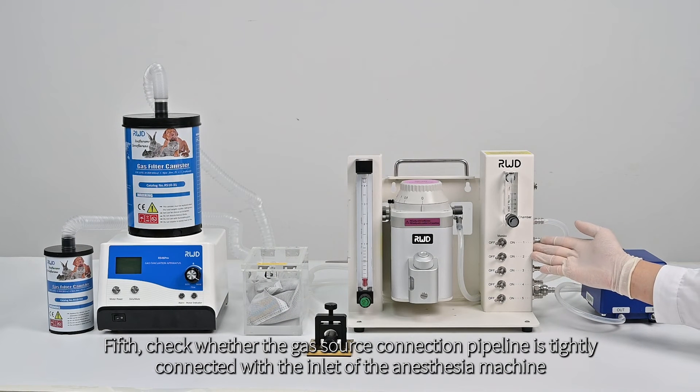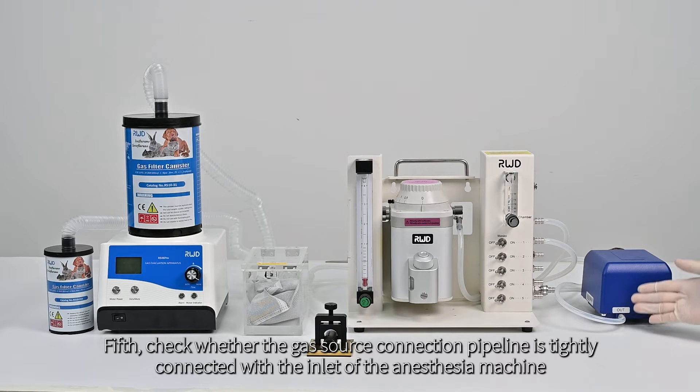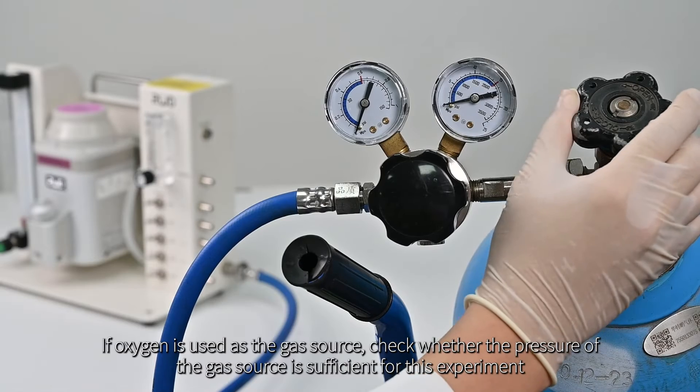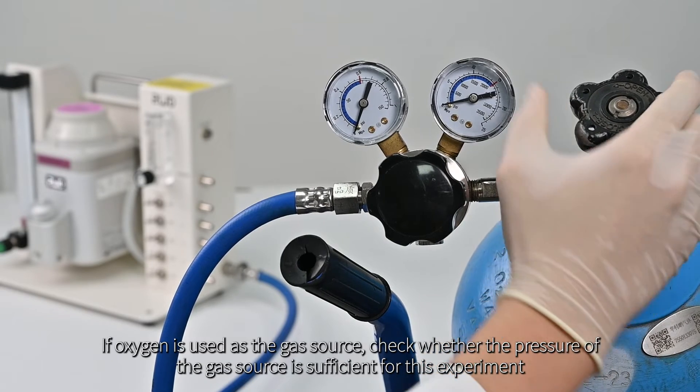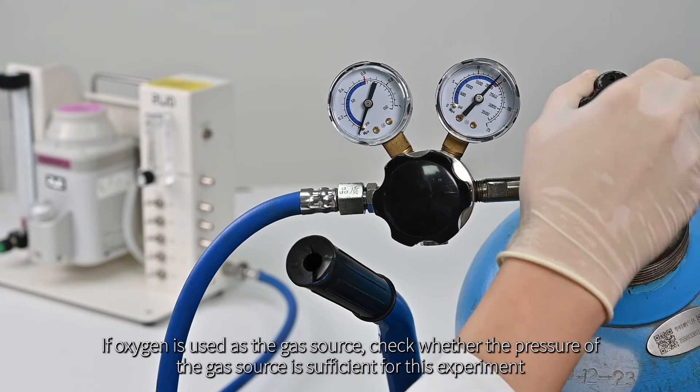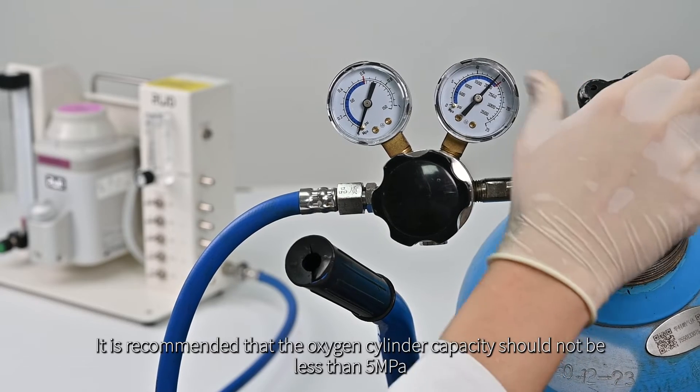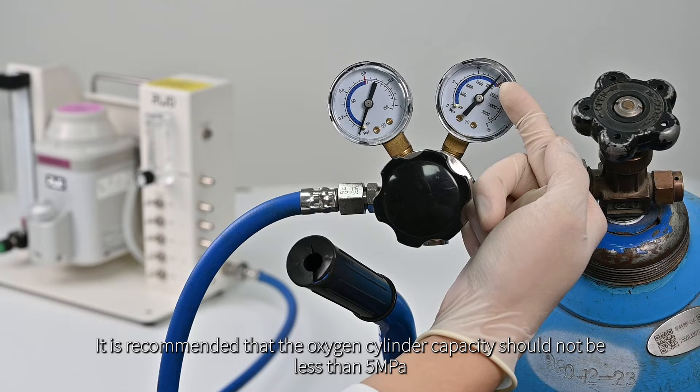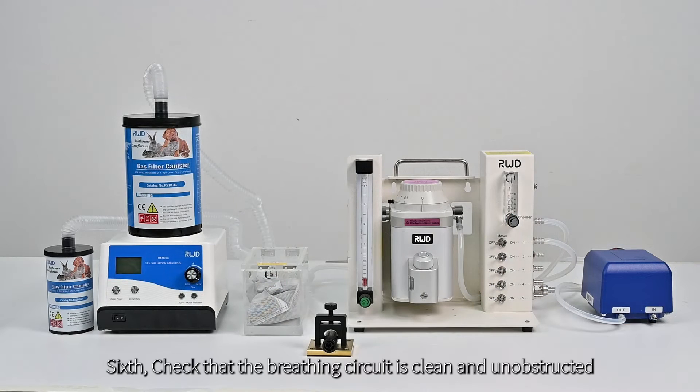Fifth, check whether the gas source connection pipeline is tightly connected with the inlet of the anesthesia machine, and there is no leakage. If oxygen is used as the gas source, check whether the pressure of the gas source is sufficient for this experiment. It is recommended that the oxygen cylinder capacity should not be less than 5 megapascal.